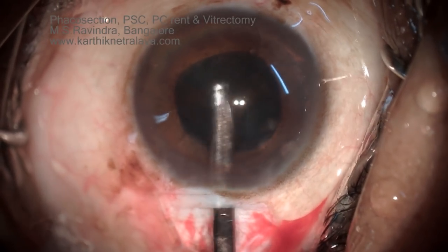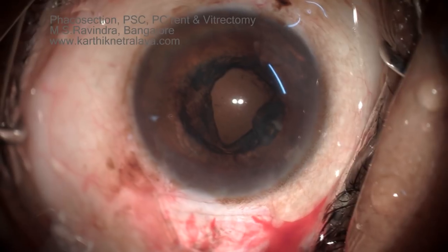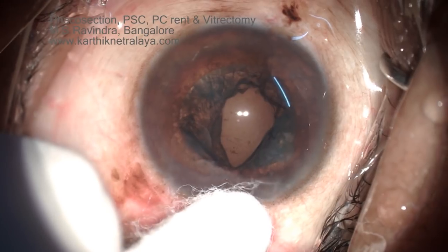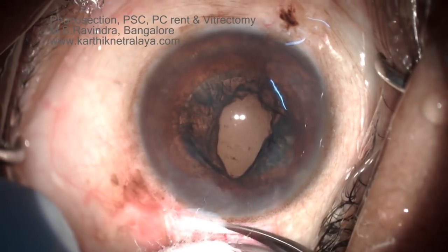Cortical aspiration was started, appearing to go well, when suddenly a gap was noted in the posterior cortex. Evidently there is a posterior capsular rent (PCR).